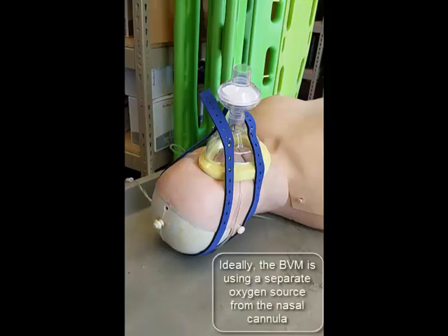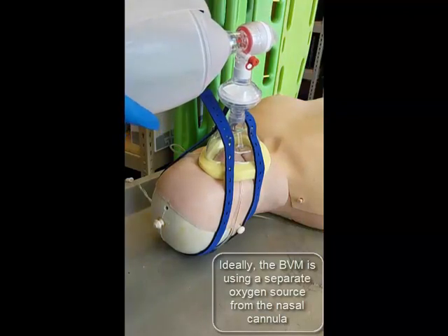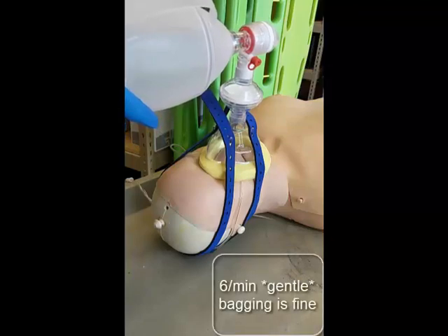At this point, we attach a bag valve mask and the patient receives six gentle ventilations per minute to supplement passive oxygenation. The BVM must be held at all times to avoid breaking the seal between the mask and the patient's face.